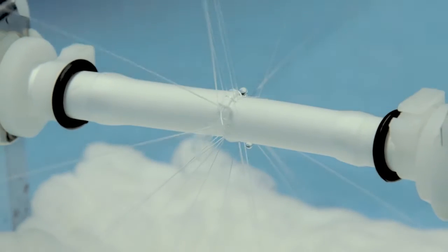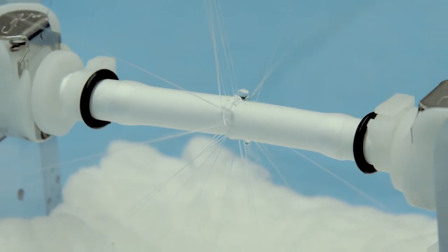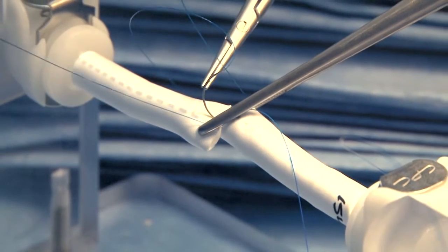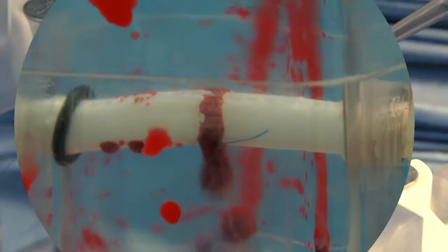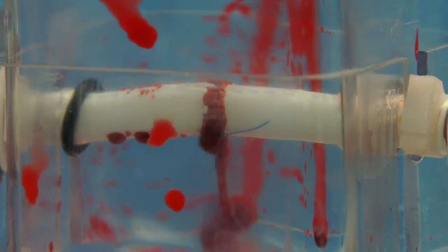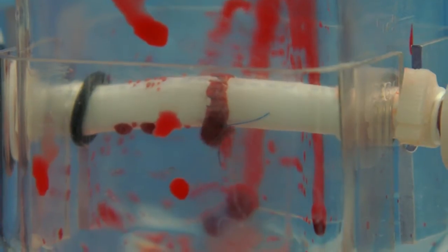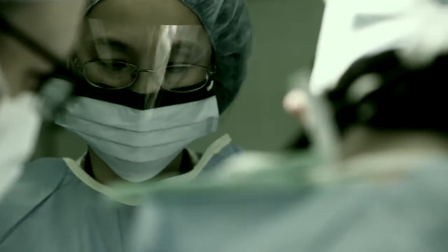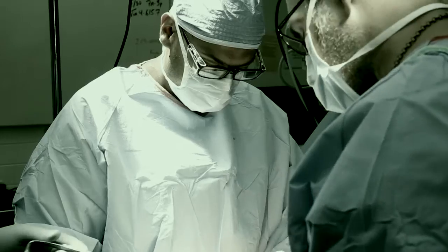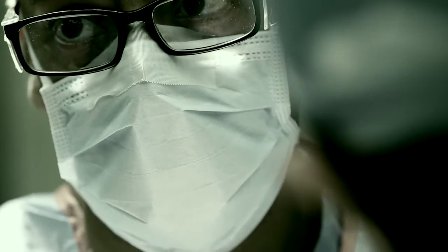Needle hole bleeding is a reality of vessel anastomosis and occurs even when ideal suturing techniques are used. The use of synthetic grafts can exacerbate this bleeding. Protracted bleeding at the suture line can increase intraoperative blood loss as well as lengthen operating time.